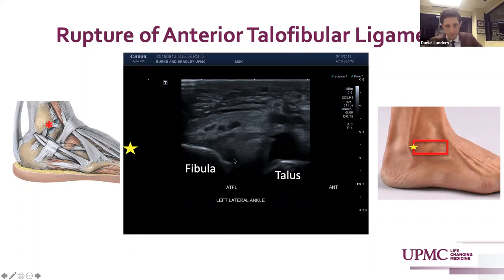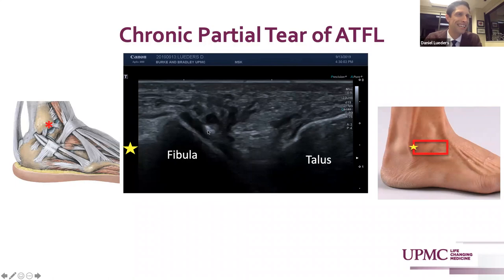More chronically, you can see attrition of those anterior talofibular ligament fibers without disruption. In this image we see what could be a small bony avulsion, except that there's no donor site — it's unlikely to be an avulsion, but rather a prominent tendinosis at its origin. And then mid-substance clefting and loss of echogenicity in the presence of chronic anterolateral ankle instability.